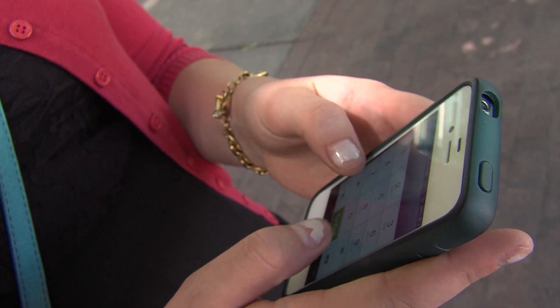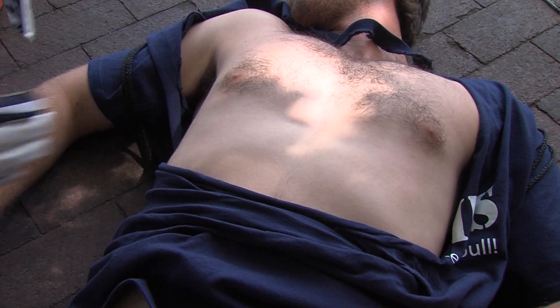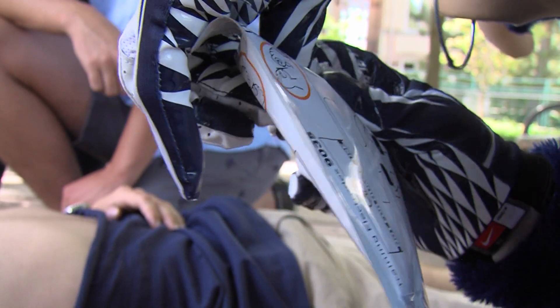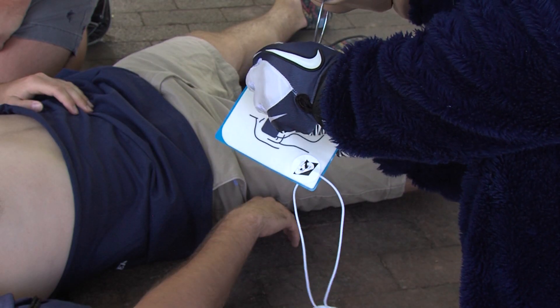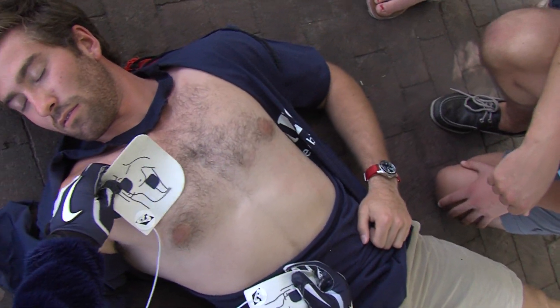Begin by exposing the patient's bare chest and torso. Remove or cut clothing if needed. When the patient's chest and torso are exposed, remove the square foil package from the lid of the AED. Tear open the foil package across the dotted line and remove the pads. Separate one of the white pads completely from the blue plastic liner, beginning to peel from the tabbed corner. Firmly place the pad without the liner on the patient, exactly as illustrated.